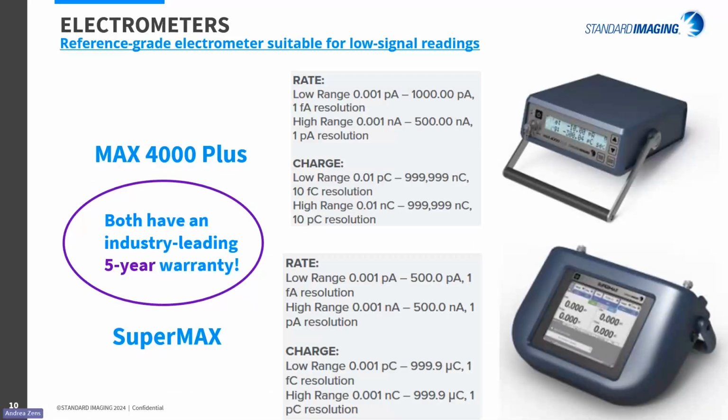As per MPG 9 instrumentation guidelines, you will also need a high quality reference class electrometer that is stable and that can be calibrated. Whether it has the range to match the signal of your detector, its warm-up time, and the number of channels are also important considerations for selecting the electrometer that is right for your clinic.